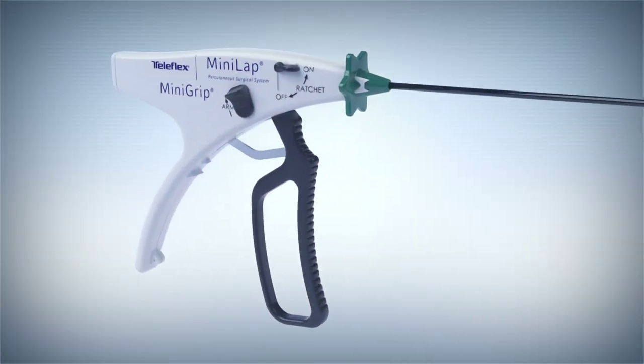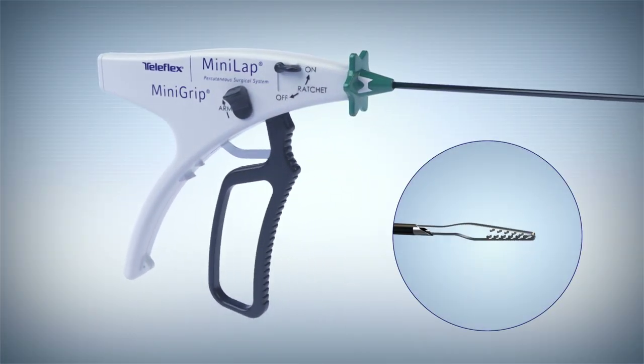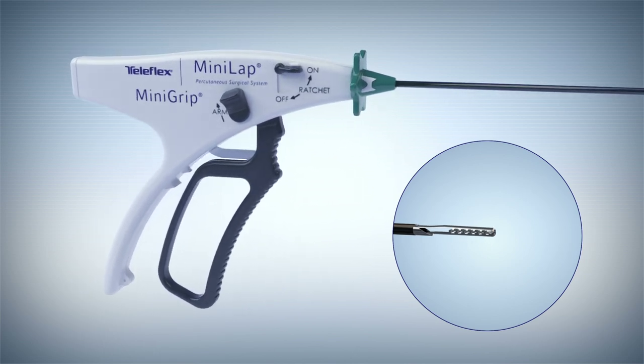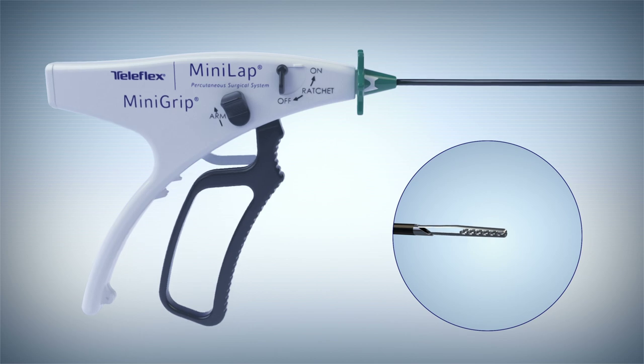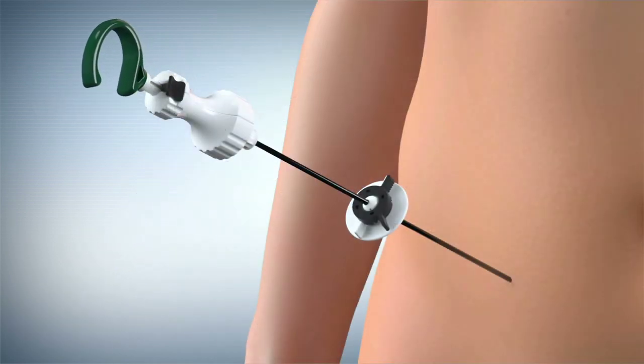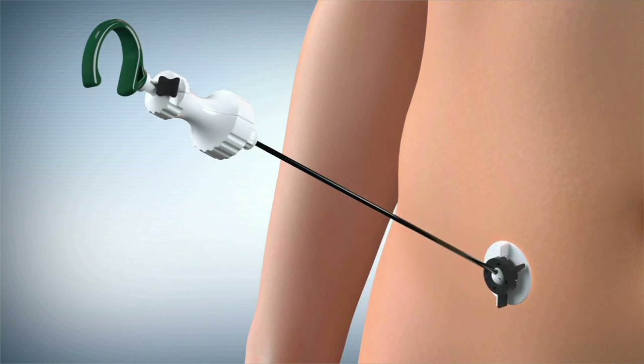The ergonomic multifunction mini grip handles make it easy for surgeons to grasp and manipulate tissue while providing both ratcheted and non-ratcheted capabilities. The jaws can be locked onto the tissue while the stabilizing pivot disc on the Minilap system with thumb grip can be used for hands-free retraction at the distance and angle you desire.